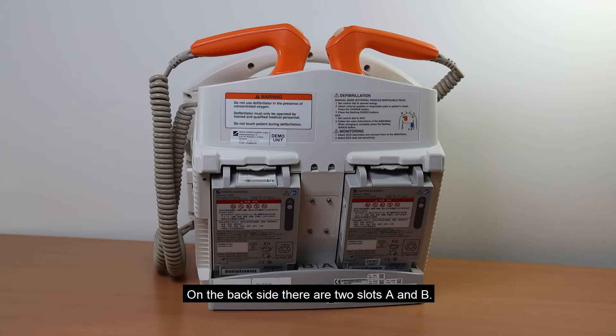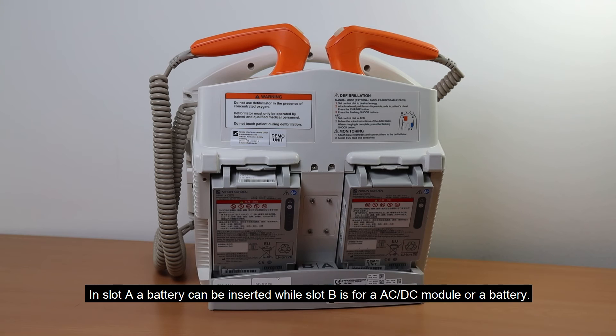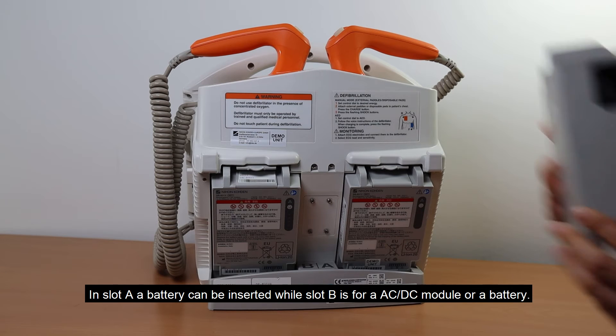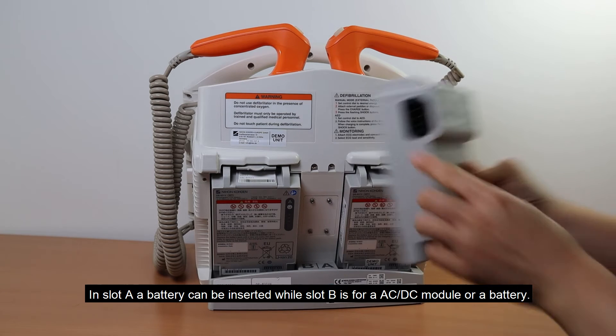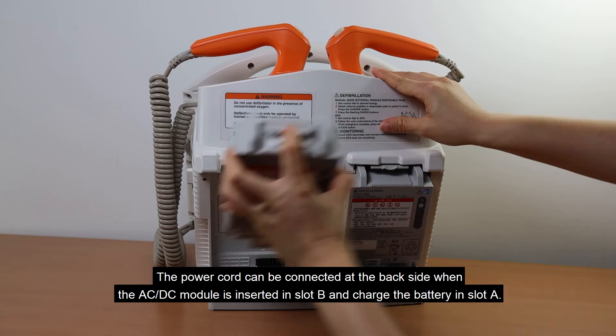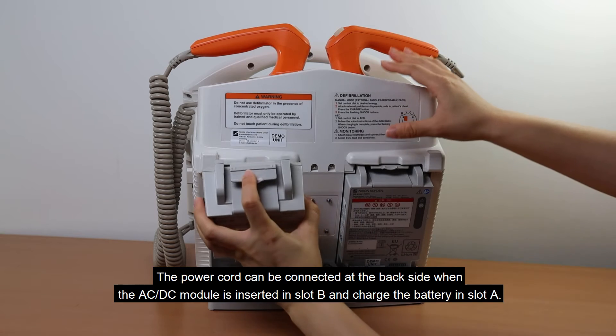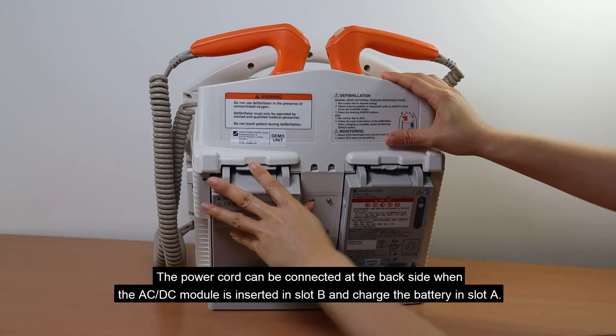On the back side, there are two slots, A and B. In slot A, a battery can be inserted, while slot B is for the AC-DC module or a battery. The power cord can be connected at the back side when the AC-DC module is inserted in slot B, and it will charge the battery in slot A.